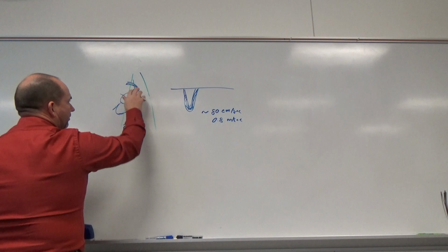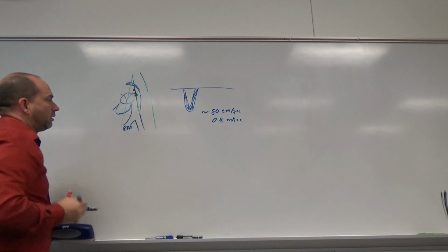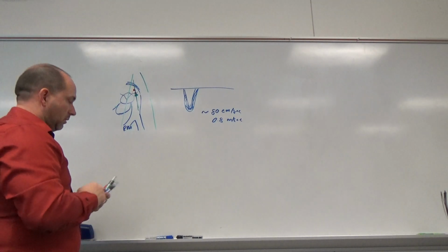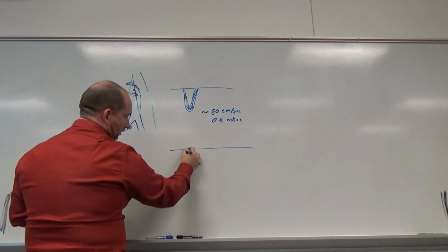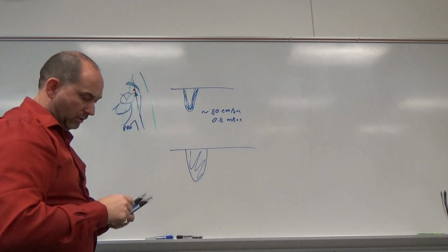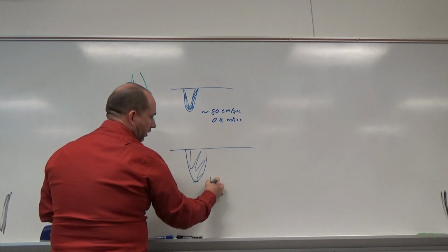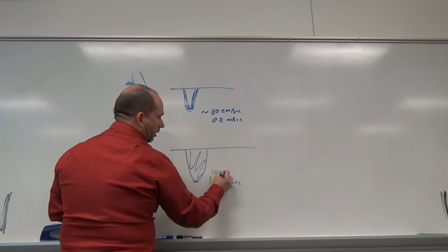Then we take off the pulsed wave and we put continuous wave through it. There's going to be a dot type thing on there. Put that just at the tips of the leaflets, roughly. It doesn't technically focus, but it actually does focus a little bit. The theory versus the reality. Okay, continuous wave Doppler, that's going to look similar to this. It's just a little bit faster than what the other one was. There's no spectral envelope or window, so now we simply are going to measure peak velocity on this. And we're going to be probably closer to about 1 meter per second, or 100 centimeters per second.